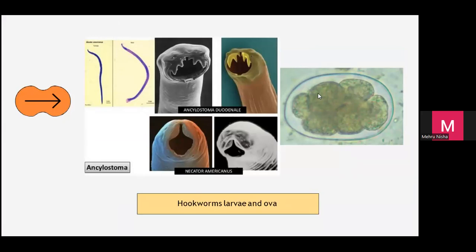Okay, tak apa. So this is the telur. So telur ni agak mudah lah nak tengok dalam slide. Tapi kalau I tanya, oh good you got hookworm dah, tapi I nak tahu spesies yang mana. Then you have to do a PCR. If from here, kalau cacing, kalau your laboratory skill memang dahsyat lah.